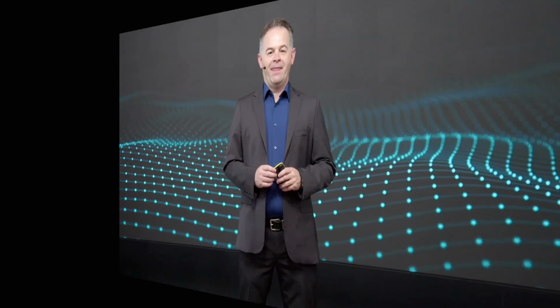I believe this short, case-based webinar will be worth your time. Enjoy! And we start this webinar already in a practical way.